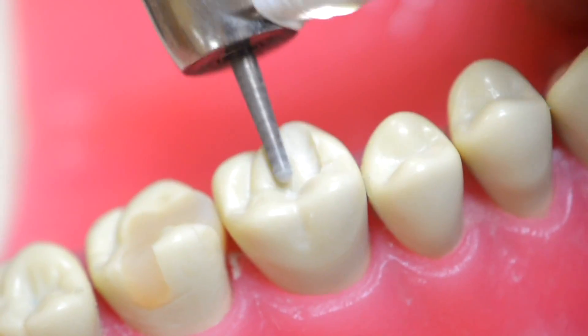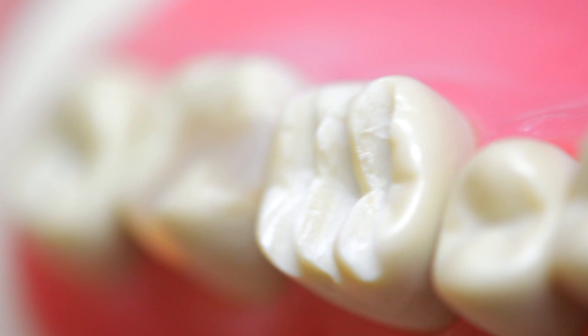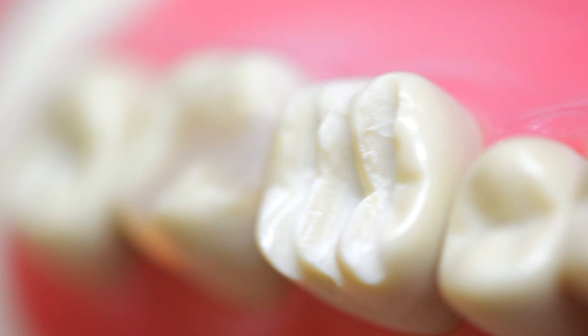But today I want to focus on the basics. For any crown preparation, you need to establish depth cuts in order to create the appropriate reduction for whatever material you choose to use. And I want to show you how that looks. Check it out.